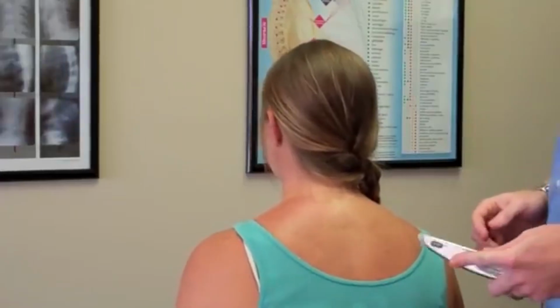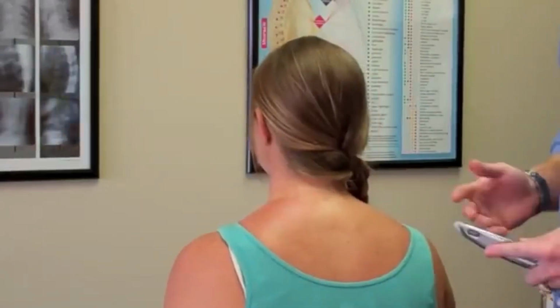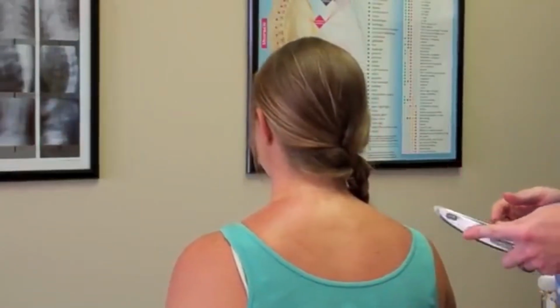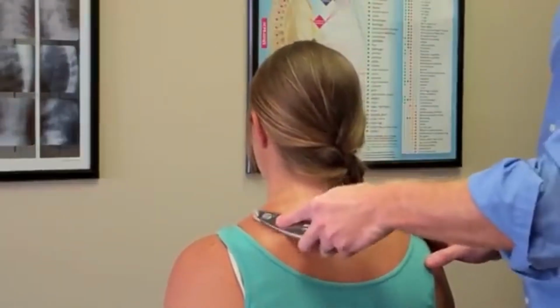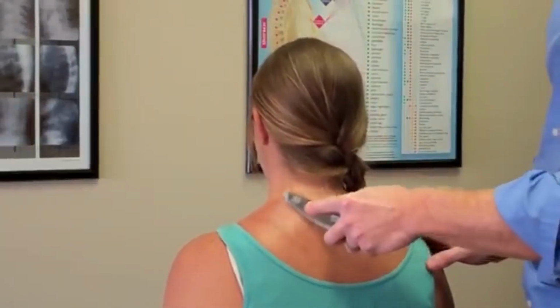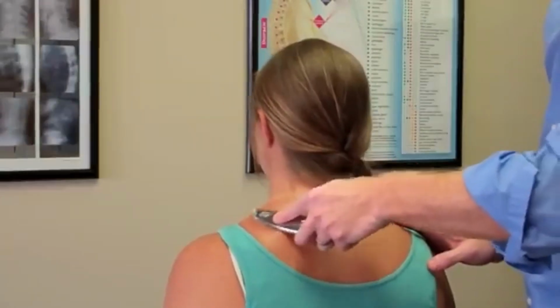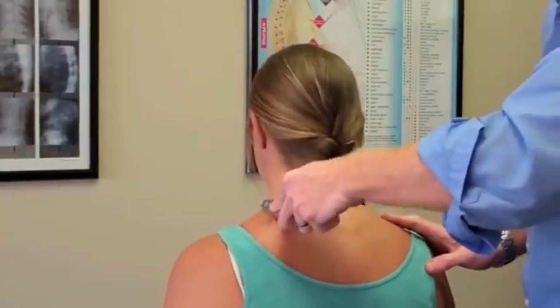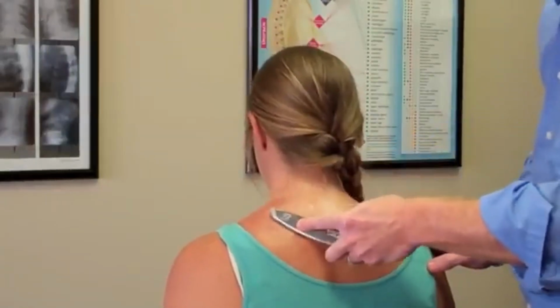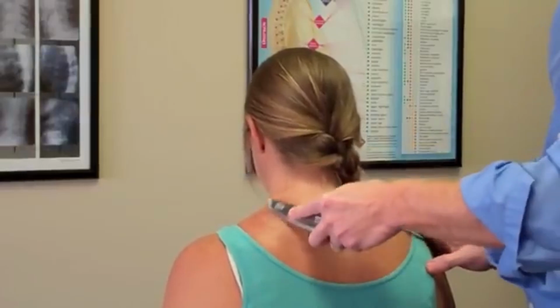So today we're working on this patient who's having some trouble with scar tissue in her neck after a car accident. So we begin by putting some emollient onto the skin to allow the Graston tools to slide over it. Now what's especially nice about the Graston tools is that they pick up the vibration from the scar tissue, so I can feel exactly where the scar tissue adhesions are.